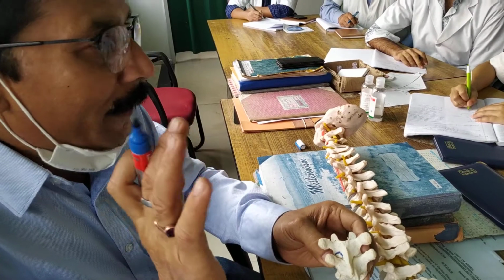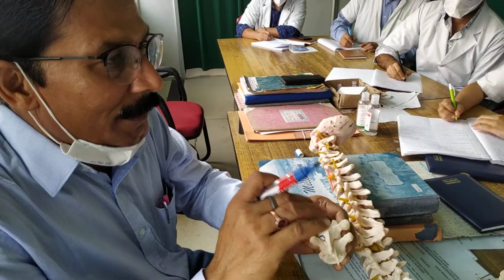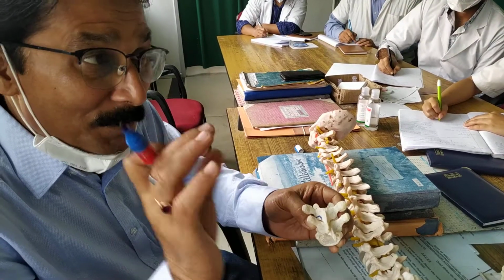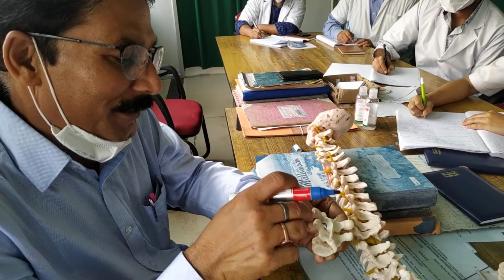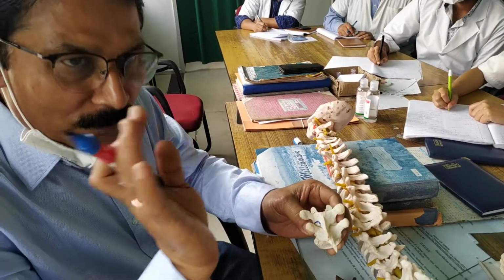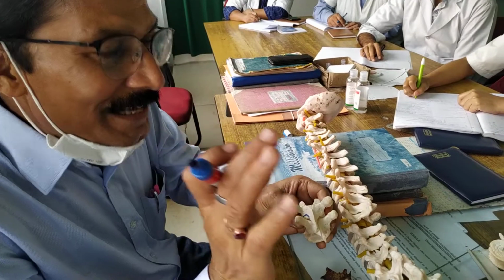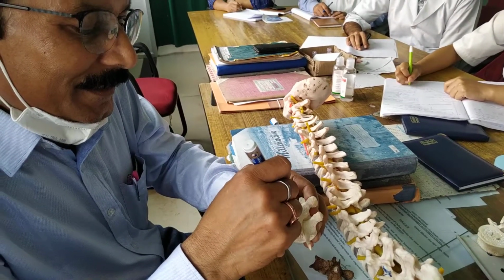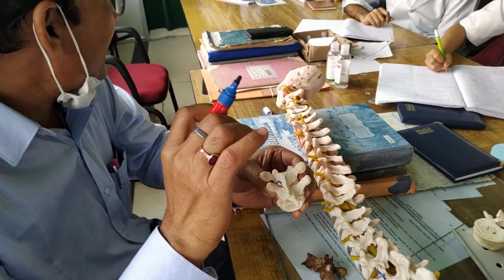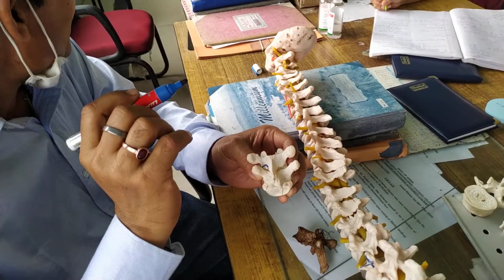Right? And the entry point of the pedicle screw in the thoracic as well as lumbar is at the base of the superior articular surface. Actually at the base of the superior articular surface. This is directly continuing with the pedicle. Yes, sir? Grossly speaking, we will calculate the orientation. But as such, the entry point of the pedicle screw, both in the thoracic and lumbar area, is at the base of your superior articular surface.